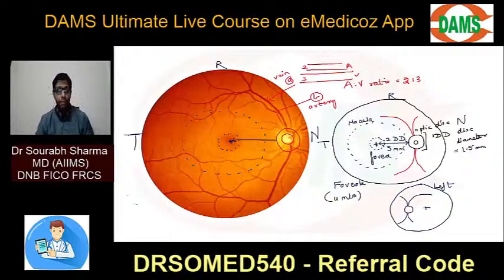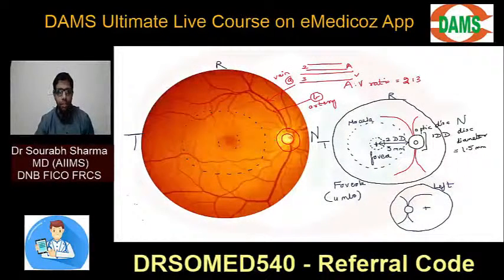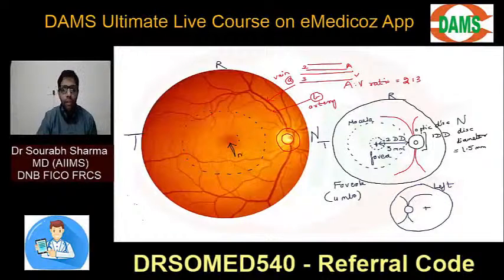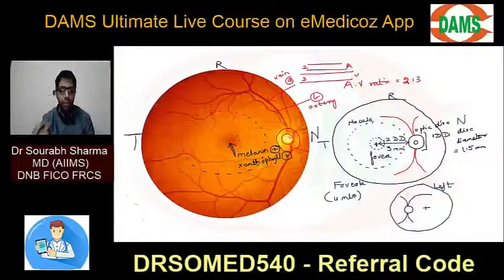Alright, but if you look carefully at this picture, can you appreciate that the fovea is a little bit darker as compared to the rest of the retina? What is the reason for this? Why is the fovea a little bit dark? Very important point. Because the fovea has a high concentration of pigments. What are the pigments? It can be xanthophyll, it can be melanin. So there is more pigmentation at the central retina, the fovea, and that way it appears dark in the fundus picture.